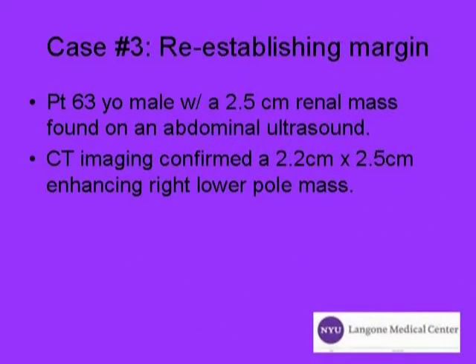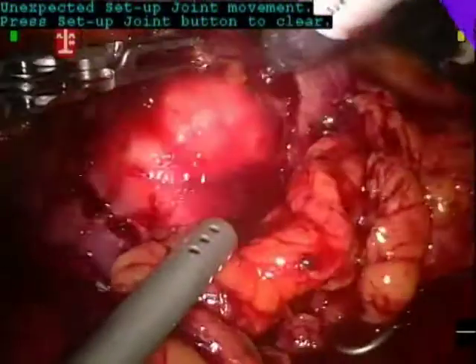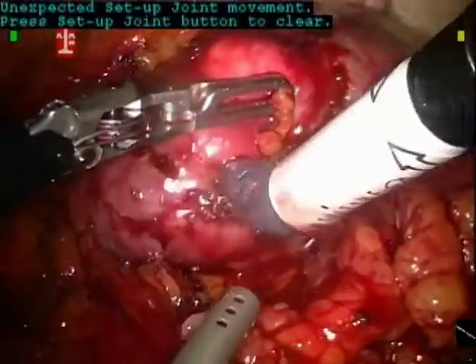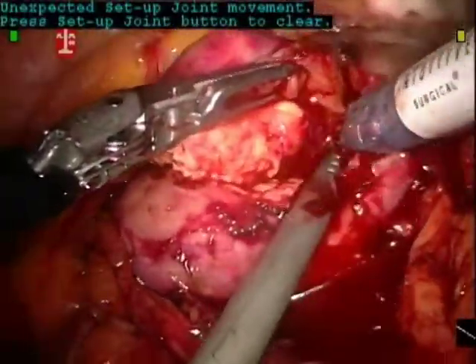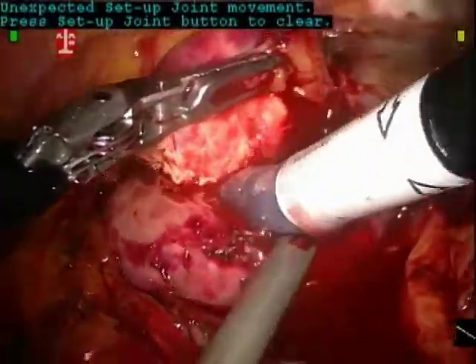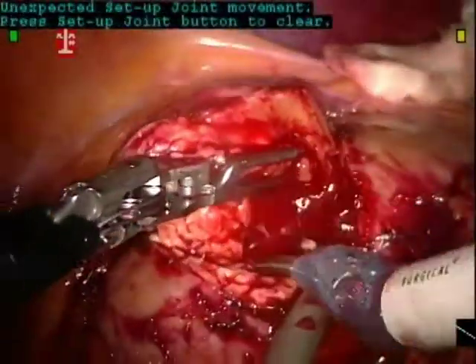Case number 3: re-establishing margin. The patient is a 63-year-old male with a 2.5cm renal mass found on abdominal ultrasound. CT imaging confirmed a 2.5cm enhancing right lower pole mass. As the excision proceeds, some bleeding is encountered.